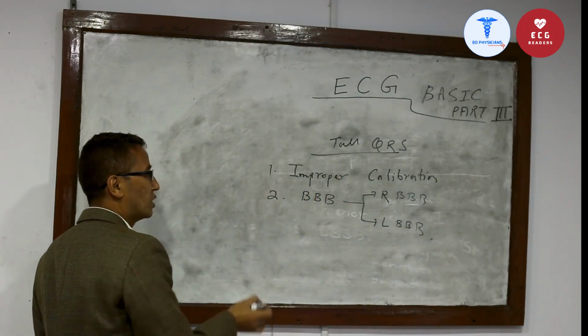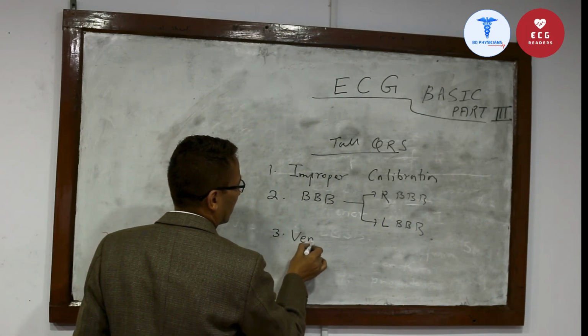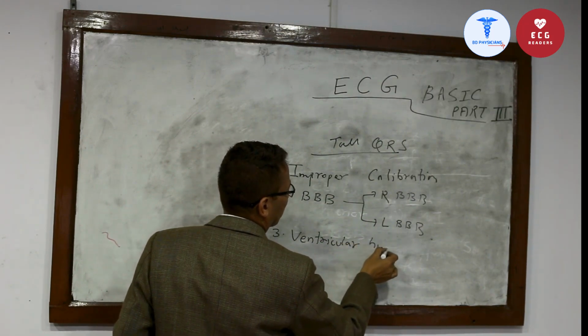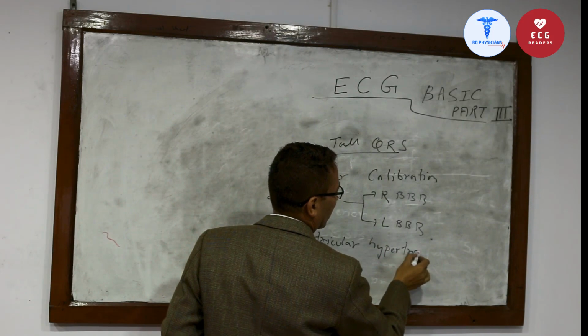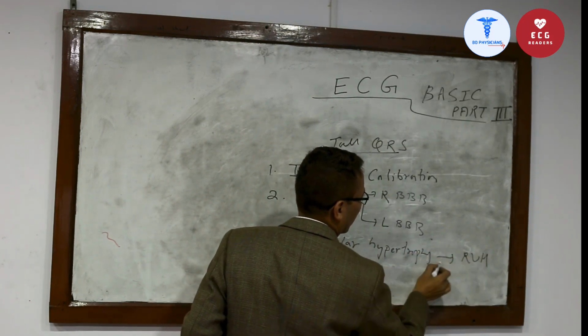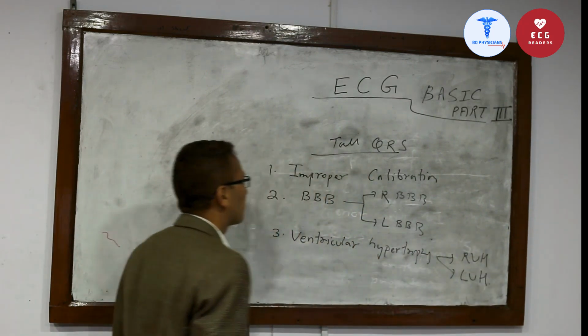It can occur in ventricular hypertrophy, right ventricular hypertrophy or left ventricular hypertrophy.